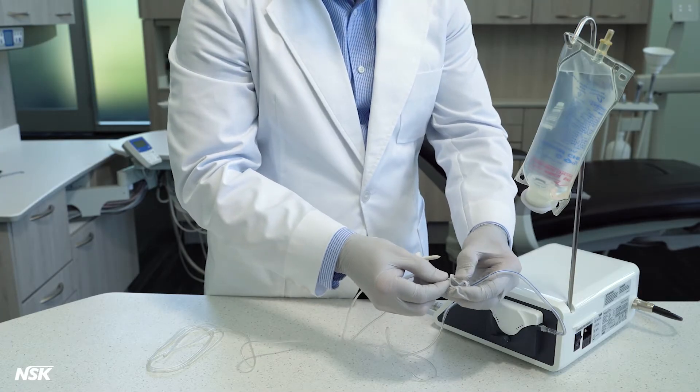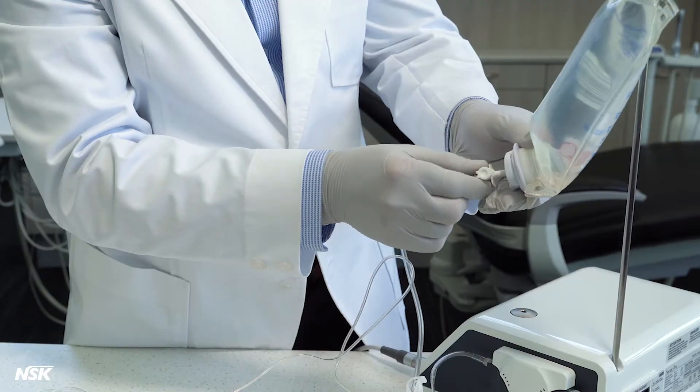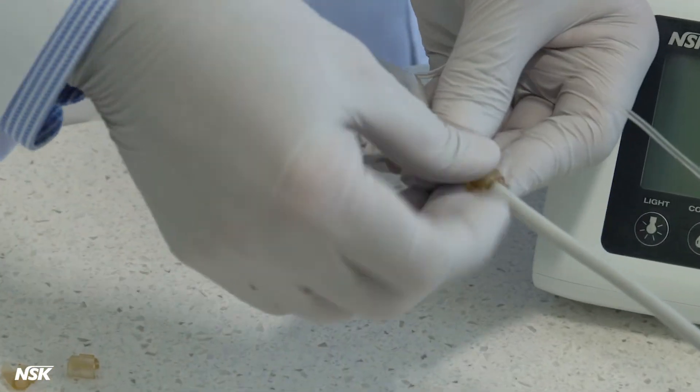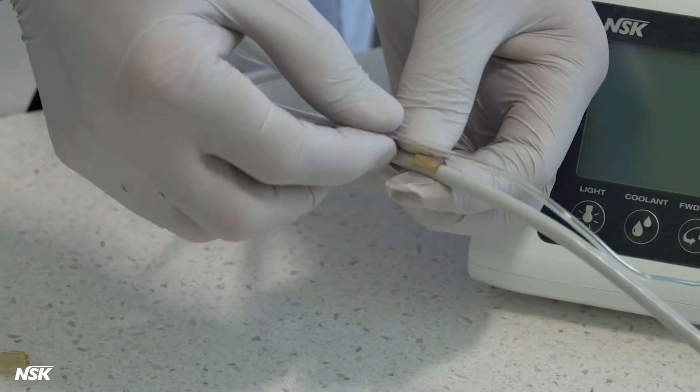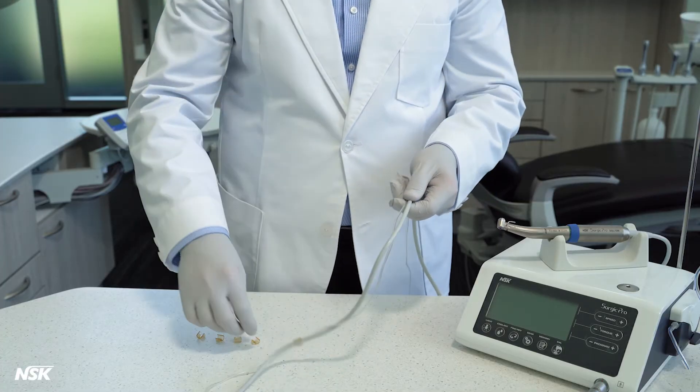Clamp the irrigation tube to stop the flow of fluid and insert the needle at the end of it into the saline bag. Attach the irrigation tube to the cord using seven holders, which are autoclavable. The irrigation tube, however, cannot be autoclaved and is single-use.